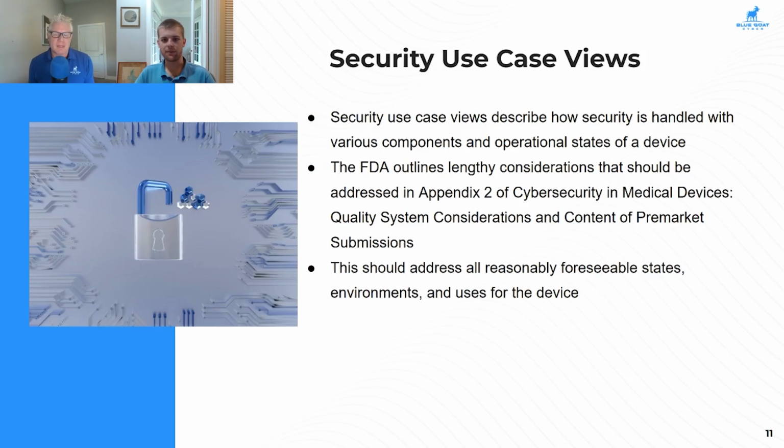Exactly. Yeah, I think kiosk mode is the perfect example, since that would be present during standby. That would be present during normal operation. But kiosk mode is usually managed by mobile device management tools, and those boot after the operating system. When a device is powering on, like if you reboot your laptop, before the operating system loads, it's loading in the BIOS, and that BIOS is loading into the operating system. So there is a window of time where the operating system hasn't loaded in yet. As such, the mobile device management hasn't loaded in yet.